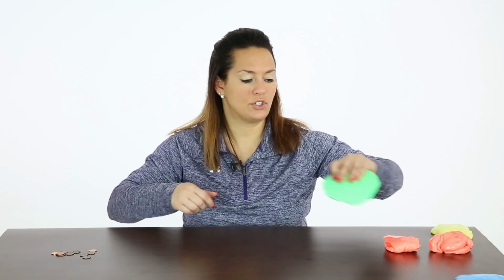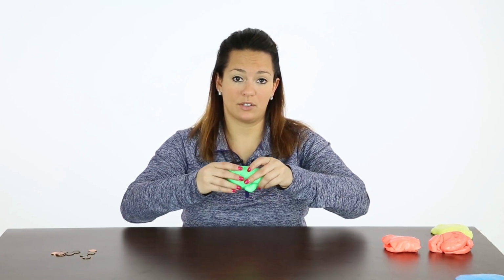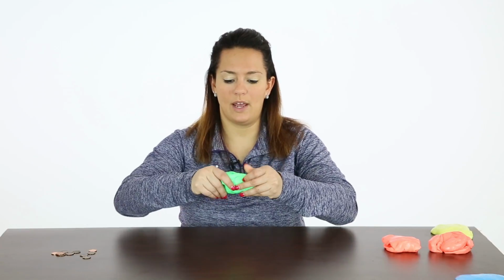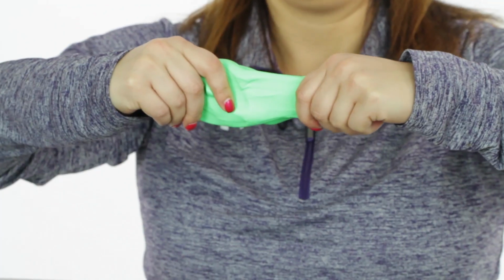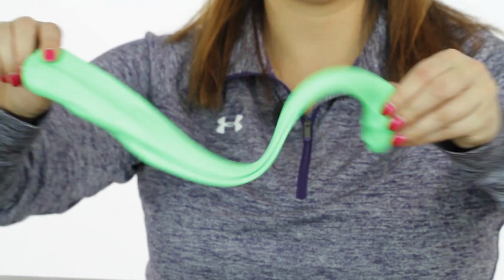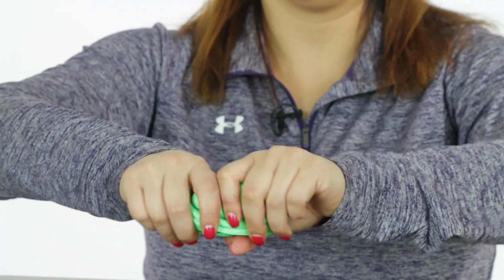Okay, next we're going to go to green. Green is the medium strength. So again, we went from extra soft with the yellow to soft with the red, and now we have green, which is the medium. So a little more resistance than the red. Requires a little bit more shoulder strength and forearm strength to pull.